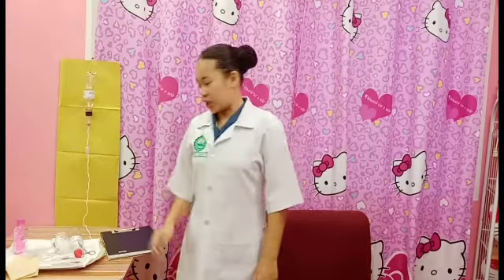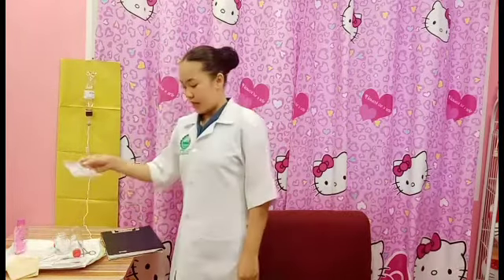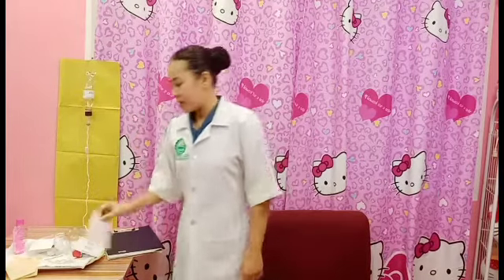The materials needed for changing of solution is IV solution as ordered by physician. And for changing of tubing, we have the administration set, sterile gauze, tape or label, IV tubing, sterile dressing and antiseptic, disposable clean gloves, and solution or ointment according to the recommendation of the agency.